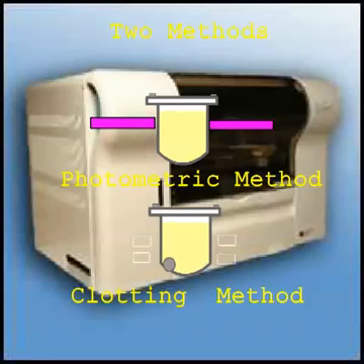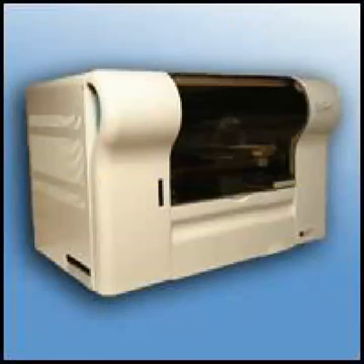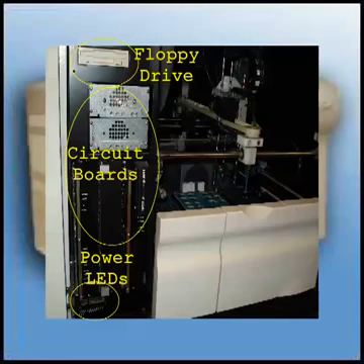Let's look at the front of the unit. The left door gives you access to the floppy drive, circuit boards, and the power supply LEDs. The LEDs show you that the unit power supply and fuses are okay and in working order. If the unit is on, all LEDs should be on.